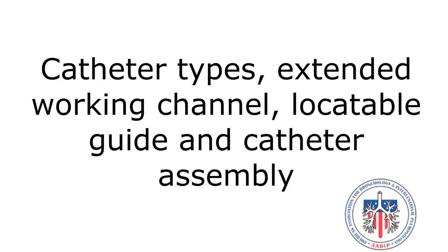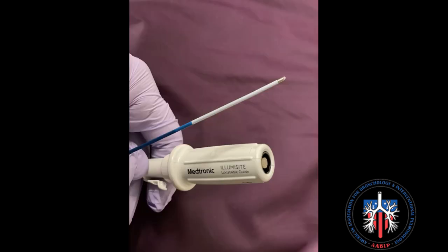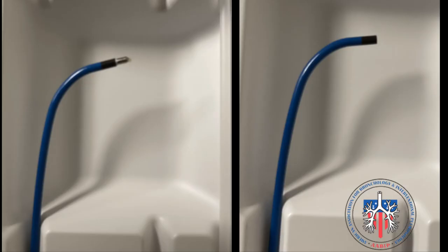Catheter types include the extended working channel, locatable guide, and catheter assembly. Catheters come in three types of curves: 180 degree, 90 degree, and 45 degree. This is a locatable guide with the proximal end that attaches to a cable and the distal end. On the right is the extended working channel without the locatable guide inserted, and on the left is the locatable guide inserted into the extended working channel.